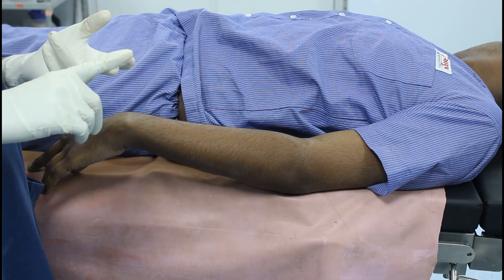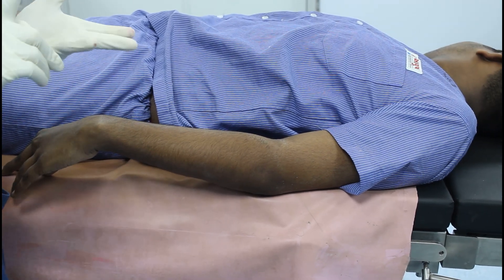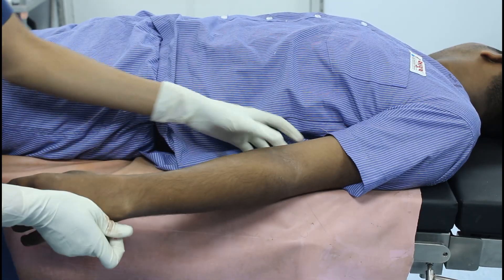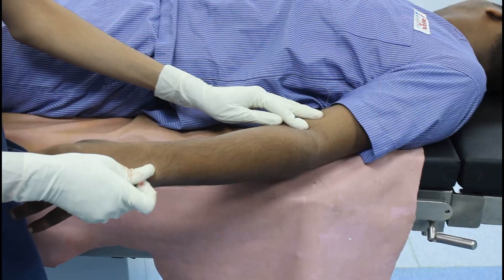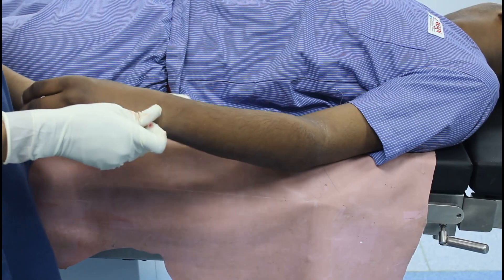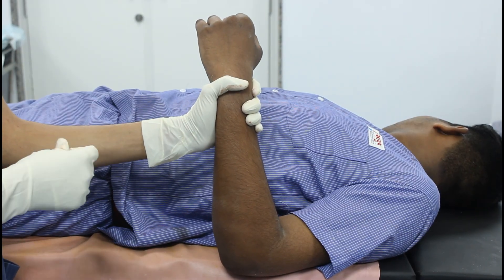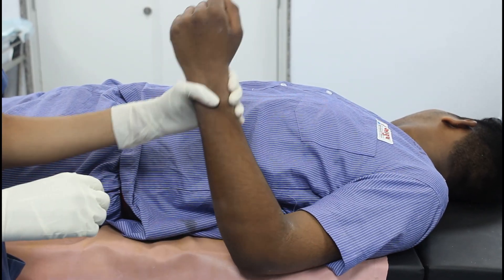Now we will check the block effect. To check the block effect we have to do four maneuvers: push, pull, pinch on the medial side, and pinch on the lateral side. First I will do the pull maneuver — I will tell the patient to lift his forearm from the elbow joint. You can see he is unable to lift his forearm, so he can't do the pull maneuver. That means the musculocutaneous nerve is adequately blocked. Now the push maneuver — you can see he can't do the push maneuver either. This checks the triceps and radial nerve response. So the radial nerve is adequately blocked.